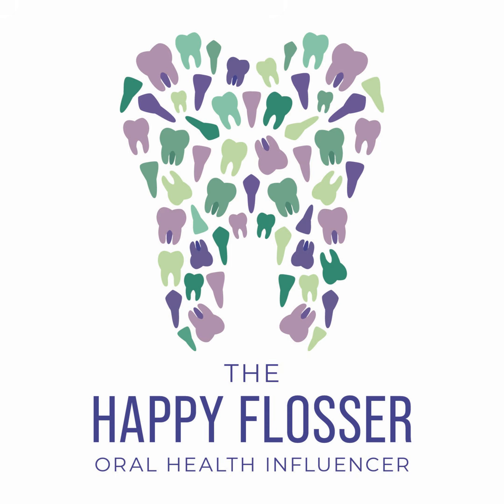When you are doing an assessment on your patient, sometimes patients are put in our schedule for different reasons. So let's just talk about your clinical findings when we're talking about the selection criteria for taking a radiograph. When you're doing your assessment, one of the main things you're looking for is their caries risk, their periodontal risk. Does your patient have obvious signs of caries or large restorations? Does your patient have obvious signs of periodontal disease or mobility?